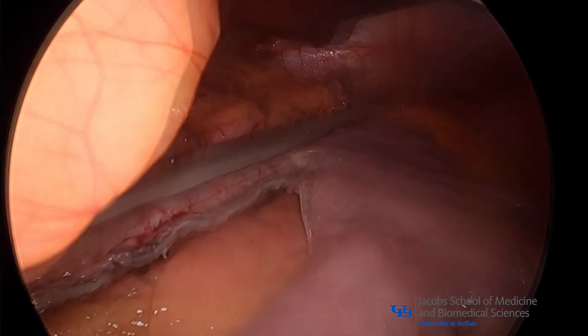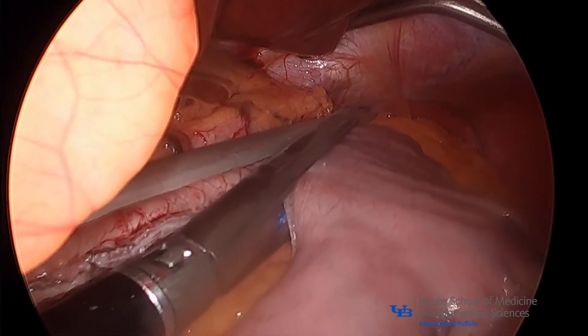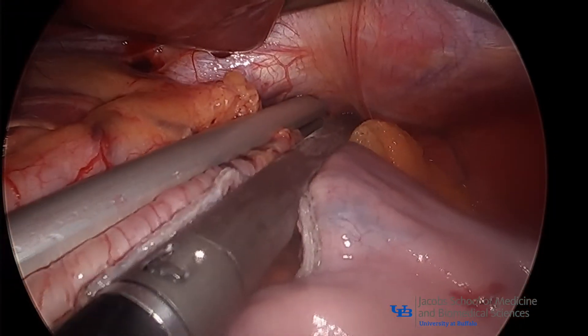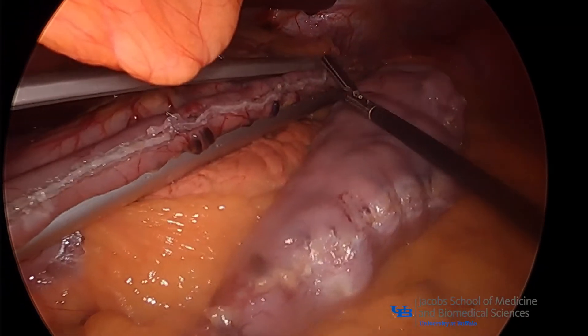Visual inspection of the gastric pouch reveals a uniform curved appearance with a staple line that is not twisted or deflected, as twisting of the pouch has been implicated in postoperative reflux and staple line leaks due to high intragastric pressures.